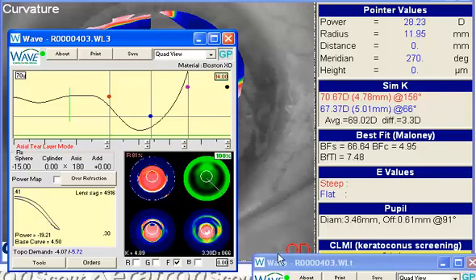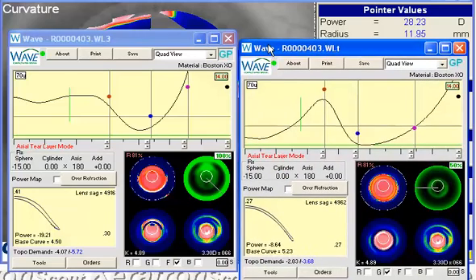So what I did is I put together a design here, and I went back to the Wave 8-point step. I don't know if you're familiar with that. I'll email you the website for it. But it's a nice little tool for designing these semi-scleral lenses. Steve Codger put that together, Dr. Codger.